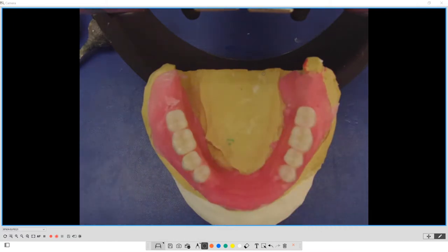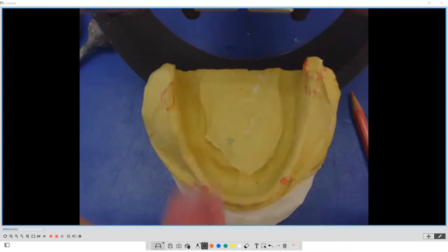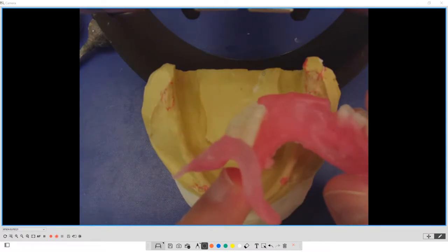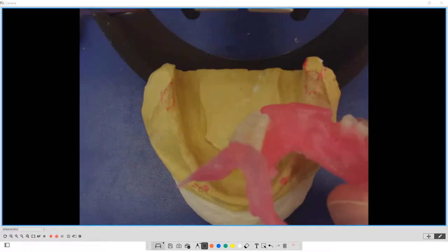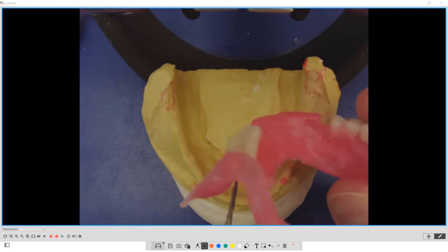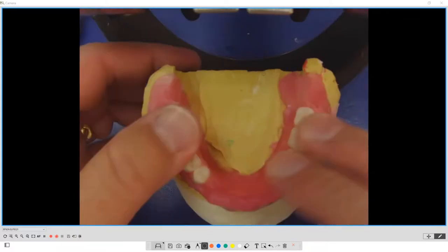So when you look at my dentures, my teeth aren't necessarily over the crest of the ridge. They're close, but I can say to you that they're not bang on, and that's okay, because I've still identified it according to Gerber and that triangle. Cool, huh?